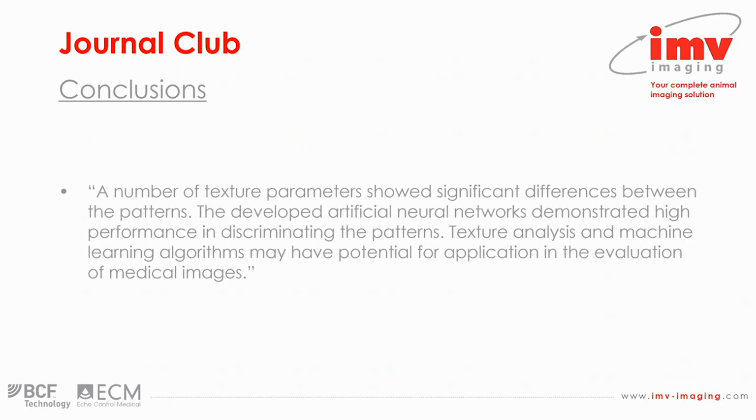So the conclusions the authors pull out from this study, and I quote this verbatim: a number of texture parameters showed significant differences between the patterns. The developed artificial neural networks demonstrated high performance in discriminating the patterns. Texture analysis and machine learning algorithms may have potential for application in the evaluation of medical images. This seems a fair and reasonable conclusion.